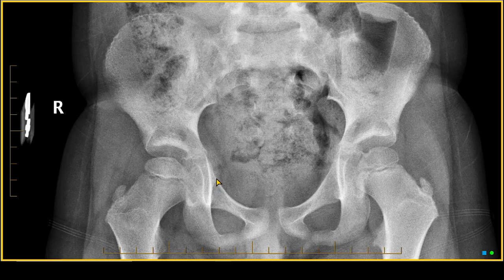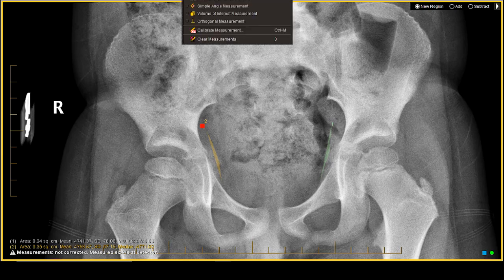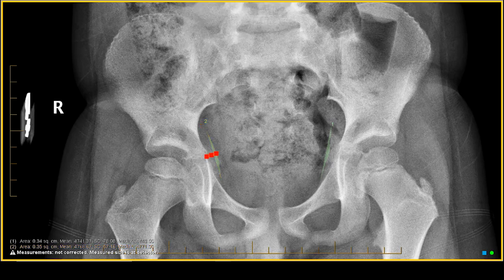Now let's take a look at some of the soft tissues around this joint and compare it to the other joint. I'm going to draw a line for you. This is the obturator internus muscle on one side, and this here is the obturator internus muscle on the other side. The distance from here to here is bigger than the distance from here to here.